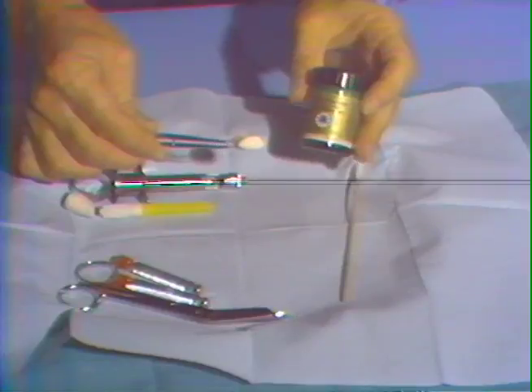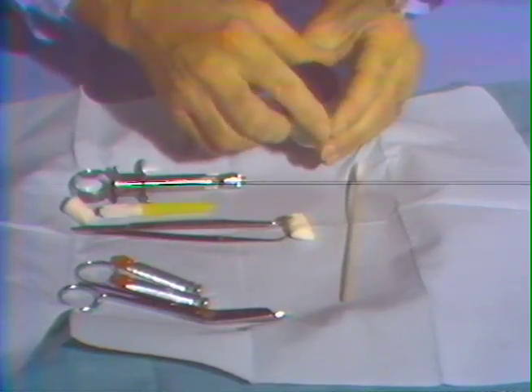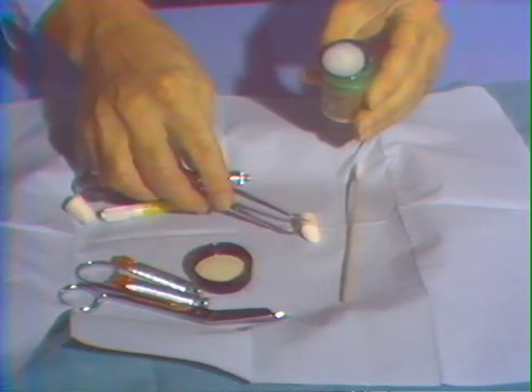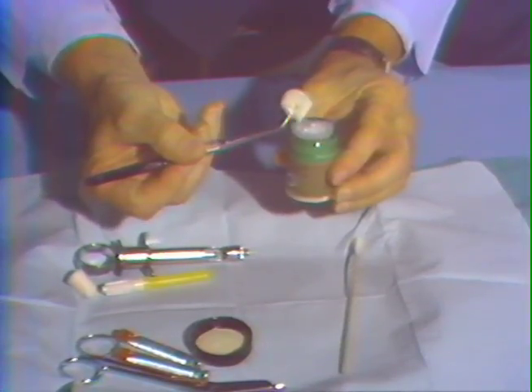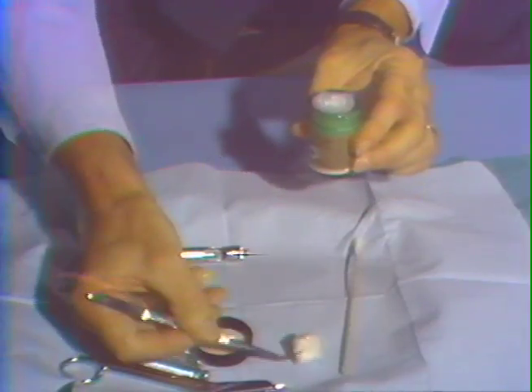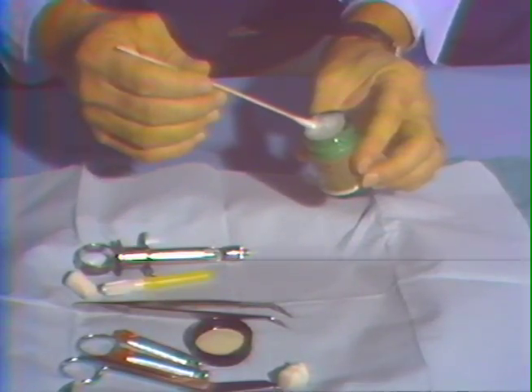Xylocaine 5% ointment will be used in all cases for topical analgesia. The ointment may be placed on the cotton roll by pressing into the ointment to trap a sufficient layer on the cotton roll. The cotton tip applicator is prepared with ointment in a similar manner.